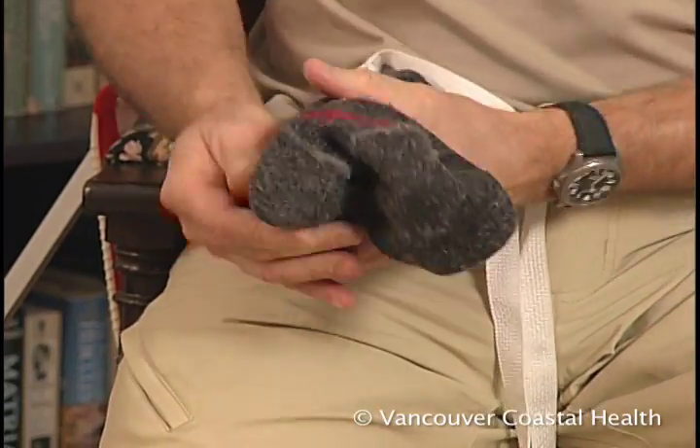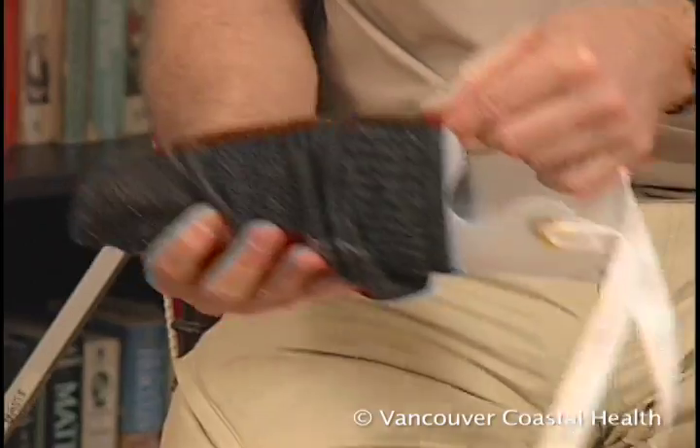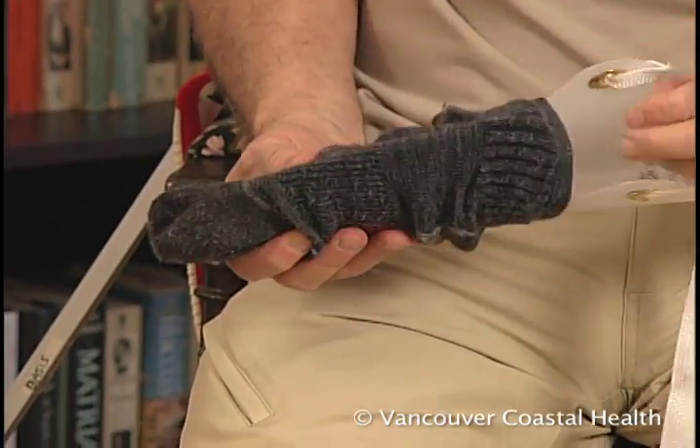Slide the sock onto the sock aid. The sock heel should be along the curved bottom with one inch of sock in the gullies.